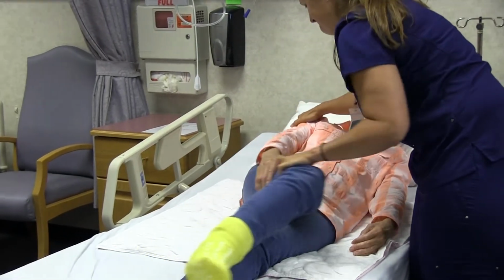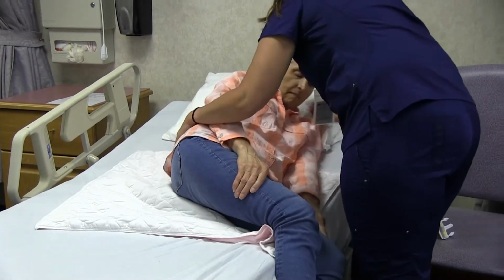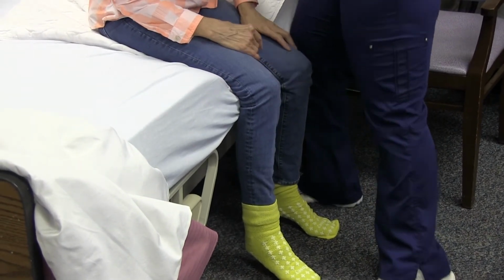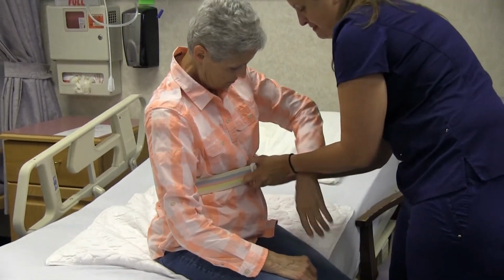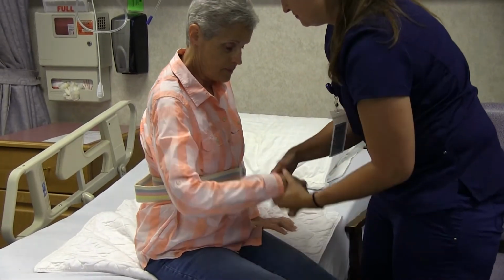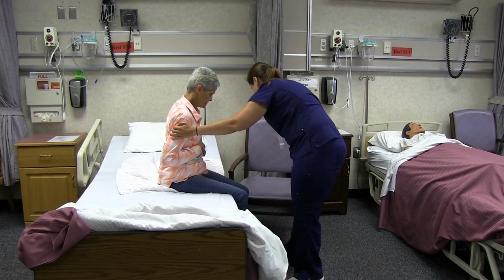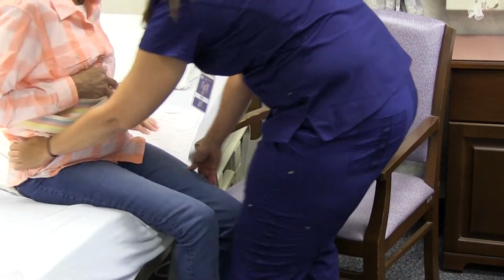Assist client to sitting position on side of bed. Allow client to sit with feet on the floor for 2 to 3 minutes. Applies gait belt snugly at center of client's gravity. Places chair on client's strong, unaffected side, as close to the client as possible. Ensures client has on non-skid slippers or socks.